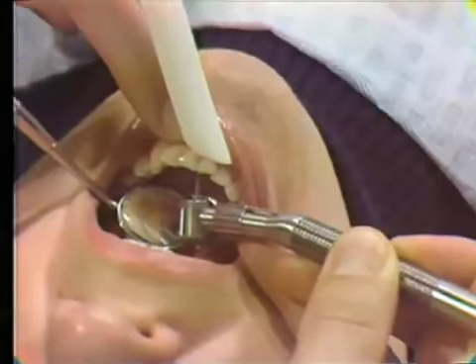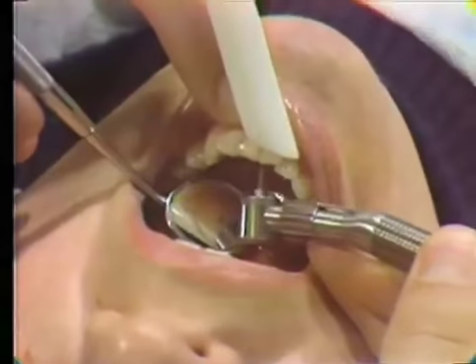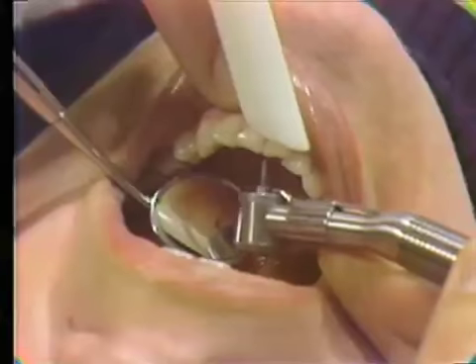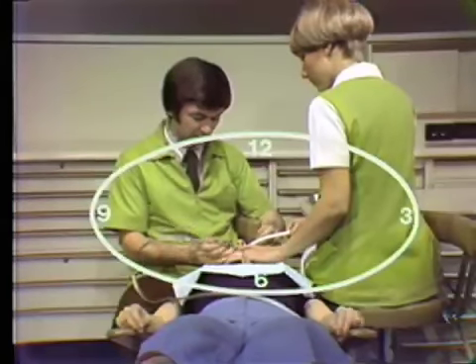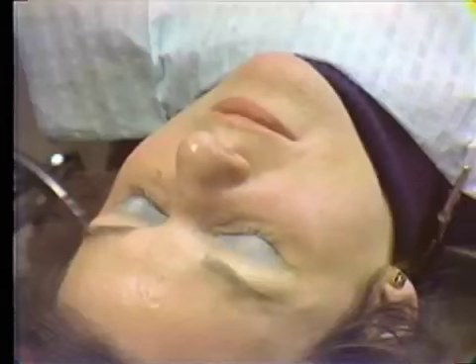Indirect vision is the usual method of choice for achieving visibility when the lingual approach is used in the mandibular anterior segment. The operator works from the 11 o'clock position with the patient supine or raised very slightly above supine. The patient's head is turned slightly toward the operator with little or no chin elevation. Retraction of the lower lip is accomplished with the index finger of the dental assistant's left hand.